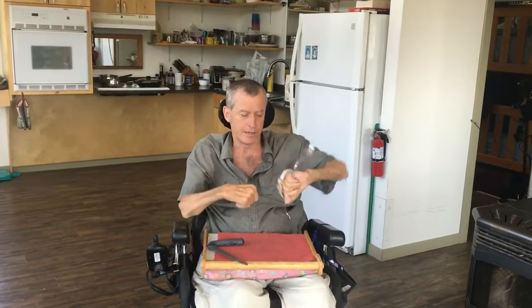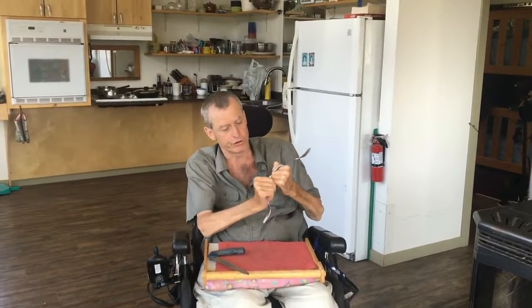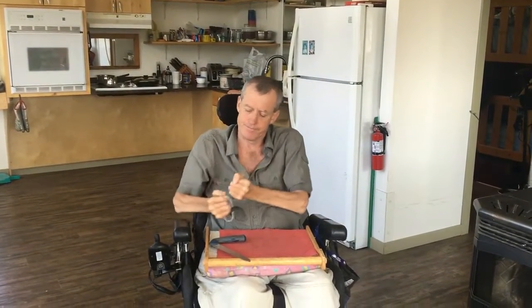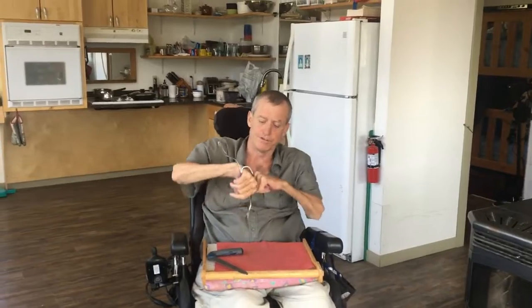Or cut everything up first, and then flip the fork around. That's a little easier to get in your mouth. And if you want to stir something up with this fork, like a salad, just flip it over to the other hand, stick it on, it's on really solid, go stir, once again, jab down, and eat.